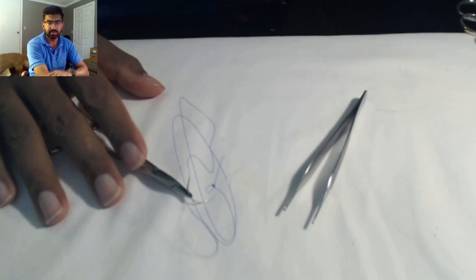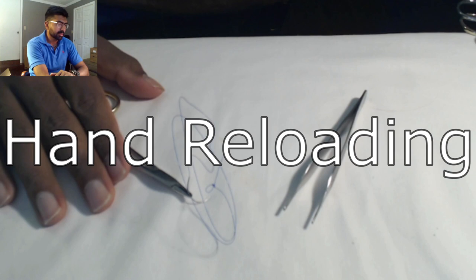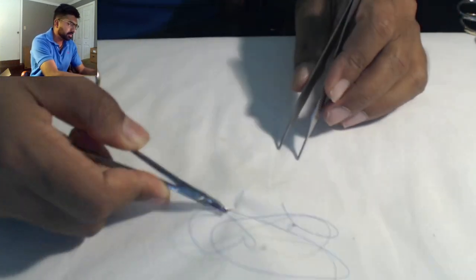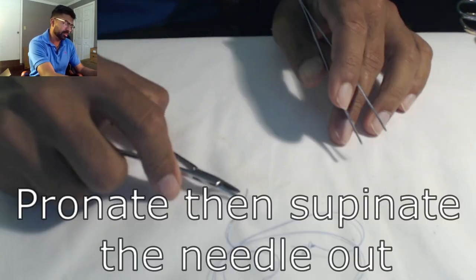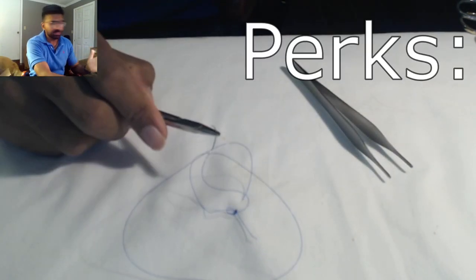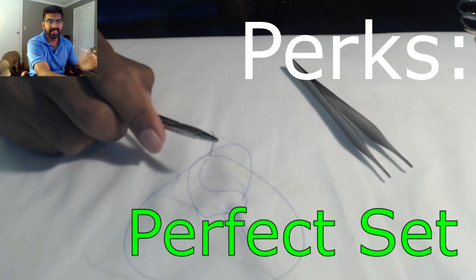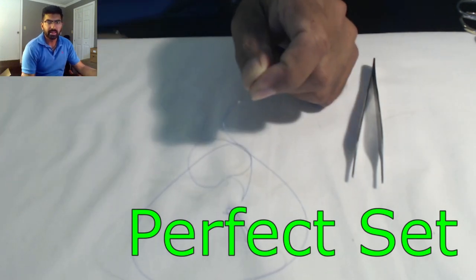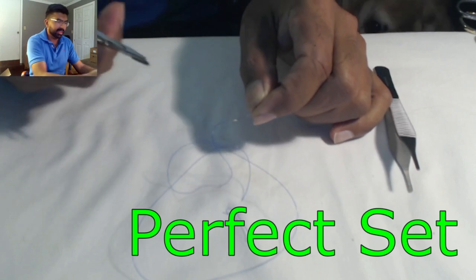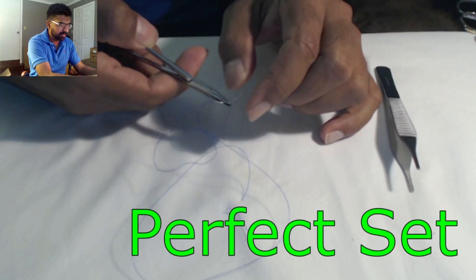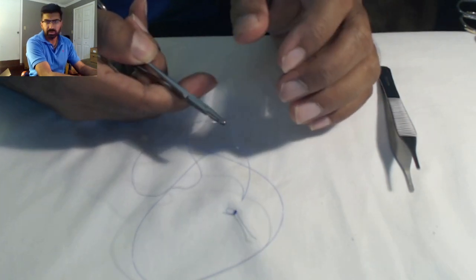Let's talk about technique number one: hand reloading. Anytime you take a bite, most people will pronate and then get the needle back. This way is nice because you can set the needle exactly how you want it to be. I grab the tip of the needle between my thumb and index finger, then I change the orientation of my needle driver and put it exactly where I want it for the next bite.